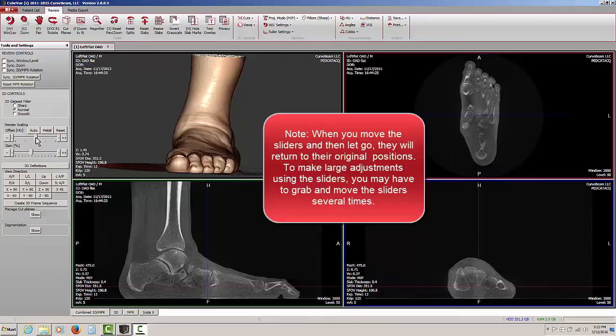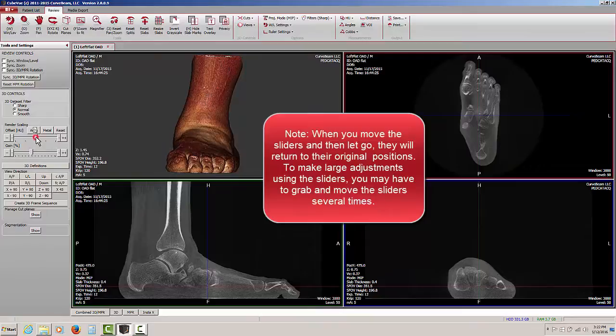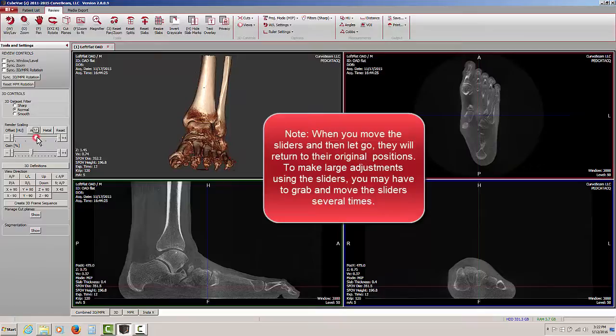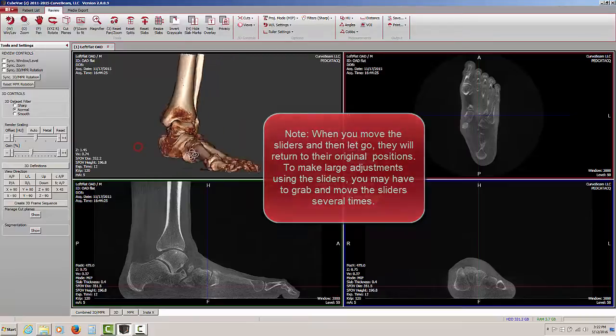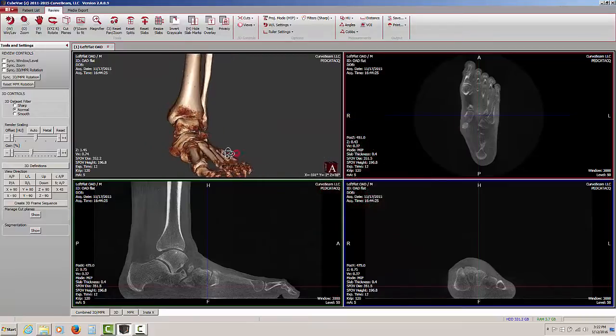One thing to note about the sliding controls: when you drag it and move it and then let go, it springs back to its original position. So you may have to make some minor adjustments several times, letting go and then maybe clicking again, grabbing it and moving it and again letting go until you've reached the desired level of density scaling.